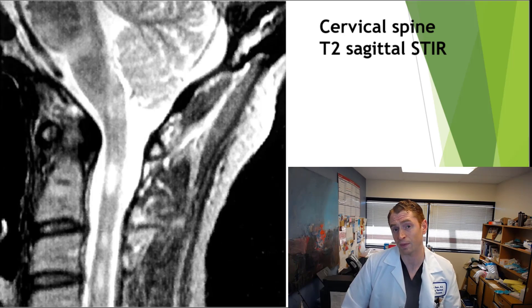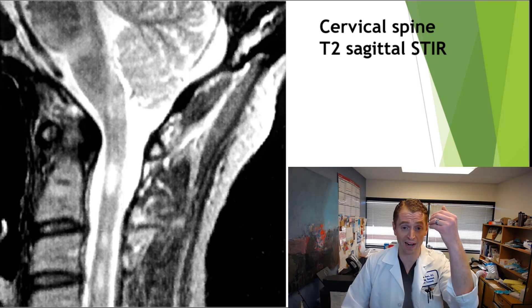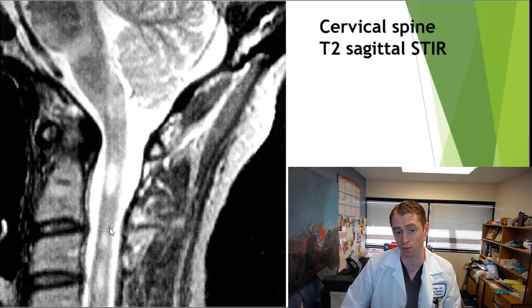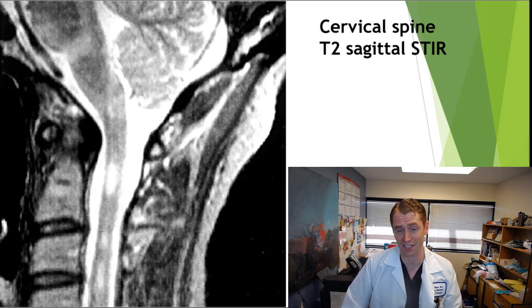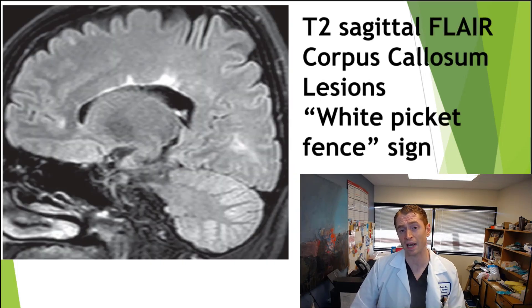In MS, if the MRI of the brain is equivocal, it may be helpful to get an MRI of the spine. Looking at an MRI of the cervical spine with sagittal images, you can see these typical multiple sclerosis lesions, though beware that not everyone with MS has lesions in the spine. Moving back to the brain, it's common for MS to involve the corpus callosum.